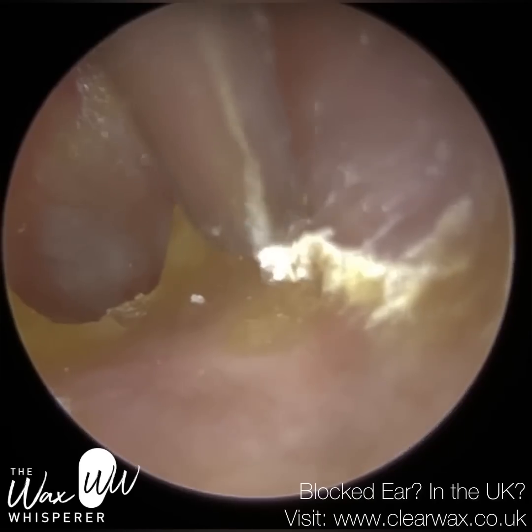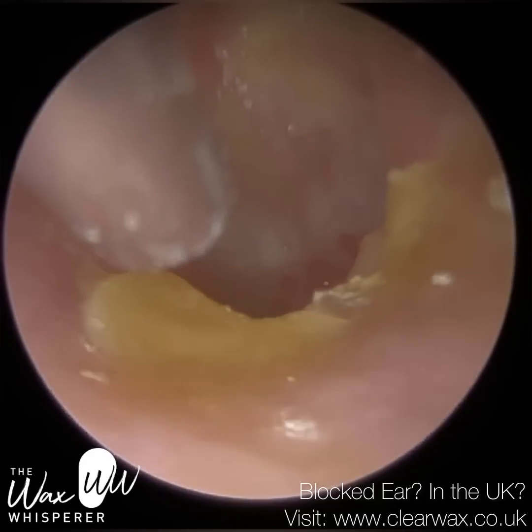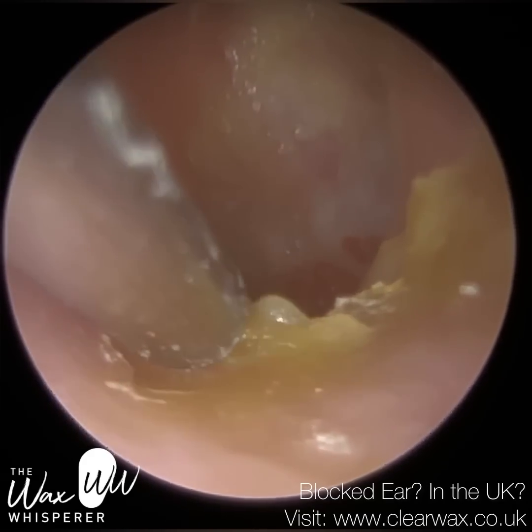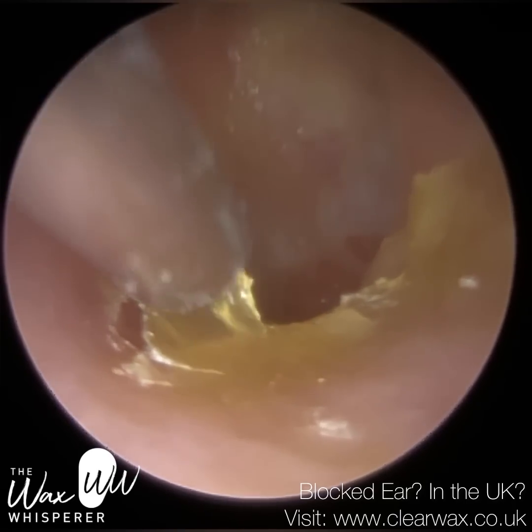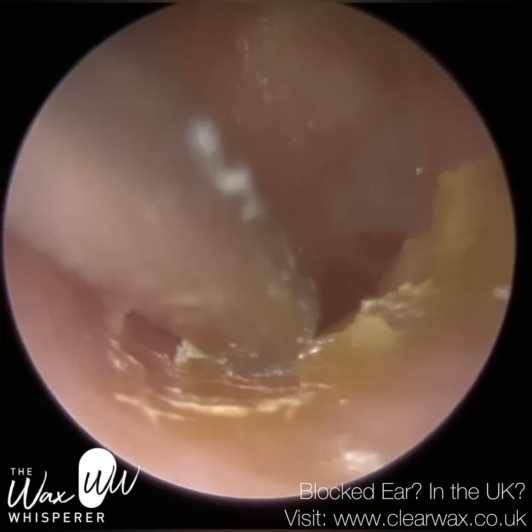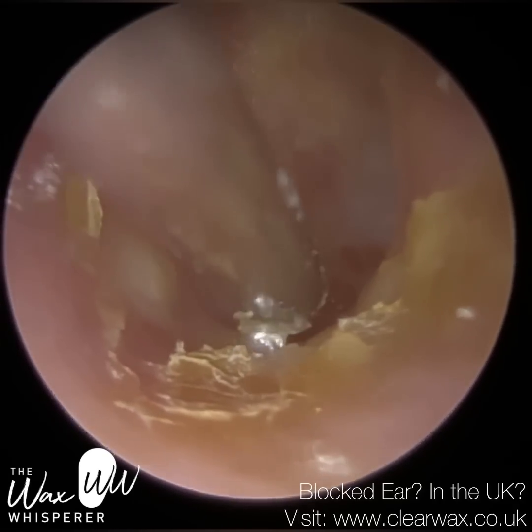But as soon as you enter with the suction probe, it defogs the lens of the endoscope. So the purpose of removing this dead skin is just to reveal the healthier underlying skin, and it's probably unlikely to come out by itself. It's really adhered. And when this patient does begin to use the topical antibiotics, it can penetrate and make contact with the surface of the epidermis layer of the ear canal.